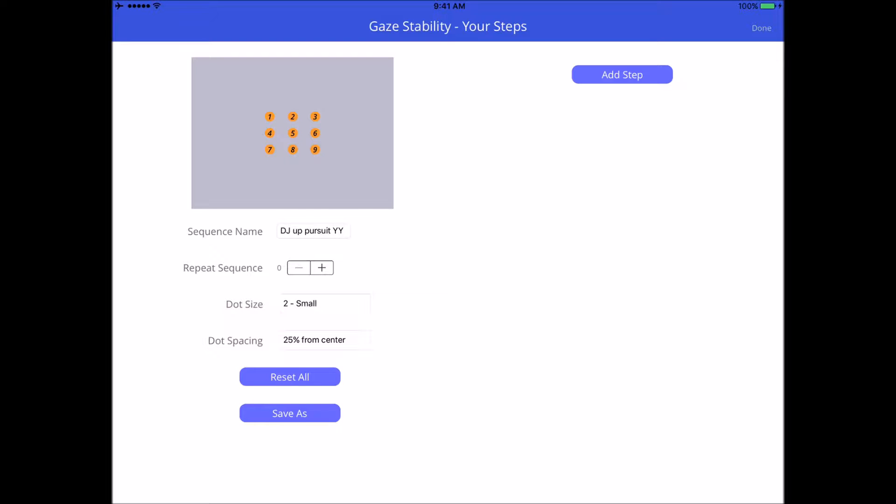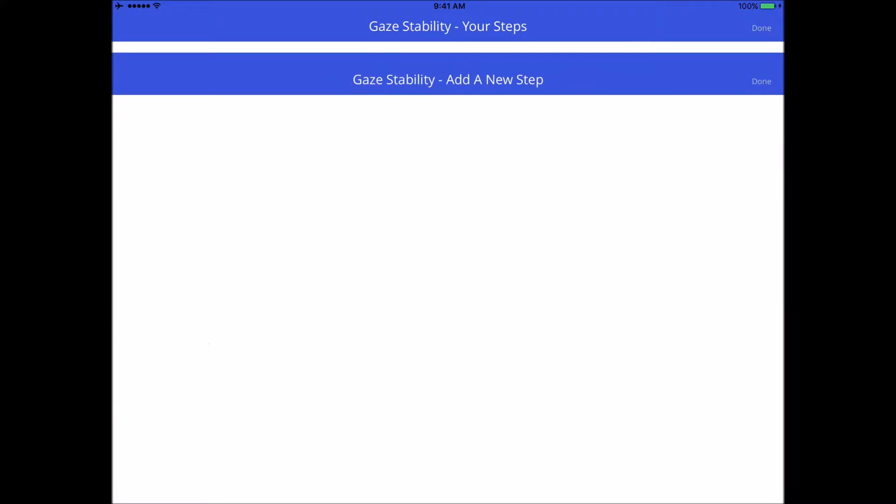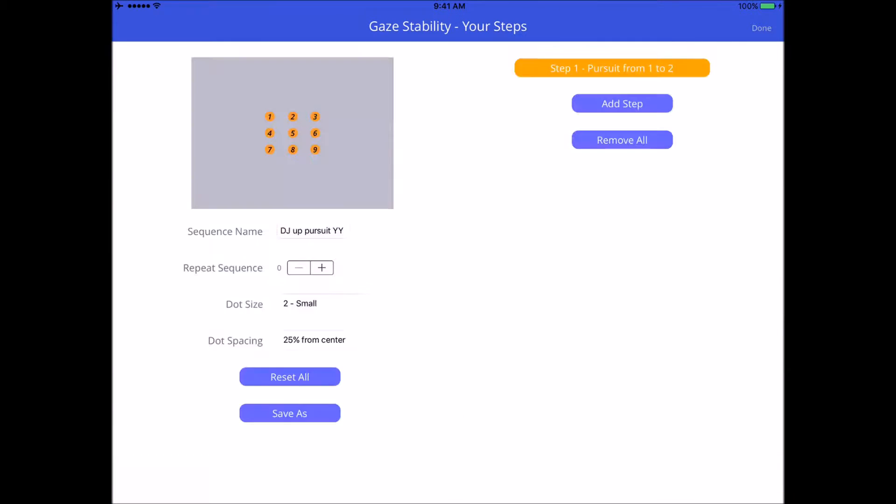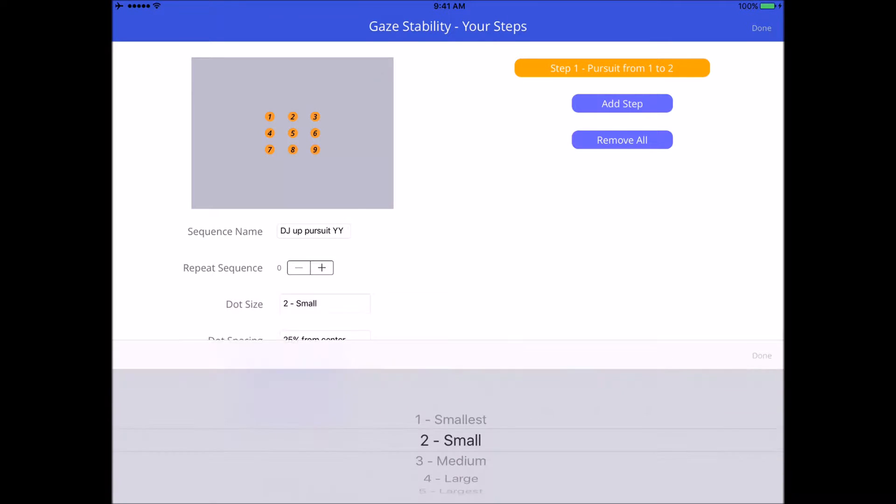The second line, you see repeat sequence. We're going to create a sequence of exercises. You see the steps on the right-hand side, add step, and as you add steps they'll line up in orange. You can create a sequence and have that whole sequence repeated as many times as you want. Let's keep that at zero for now.